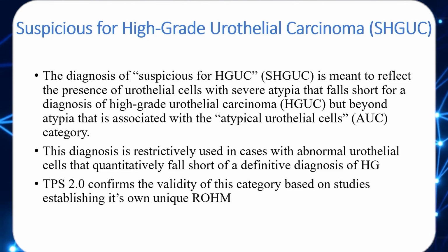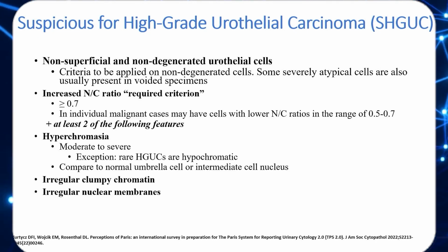So this is a distinct category that should not be discounted but still be used, again, judiciously. This should be done only when you don't have a reasonable specimen, both based on qualitative and quantitative metrics, to make an outright call.